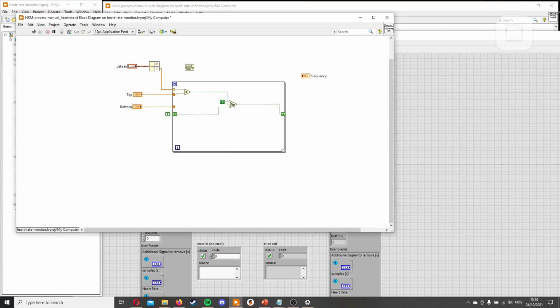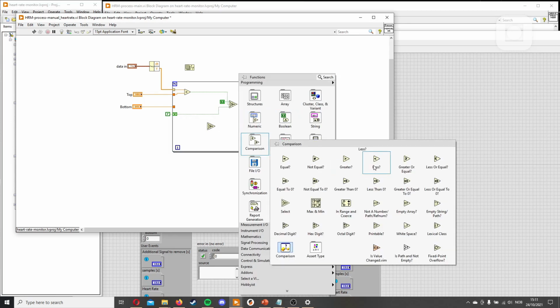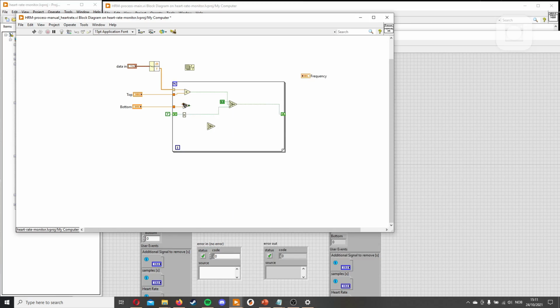What we need is a way for this to be reset every time it crosses this value. And then we can just do the same. We'll add a comparator. So anytime the waveform value is lower than this, it sets this flag low again. So now, if this value is larger than this, then this will become true. Regardless, if this is true or false, it always becomes true. And the same for this one. Regardless of what value it is here, it will become false, low, when this value is lower than this value. And from here, we toggle this on and off.